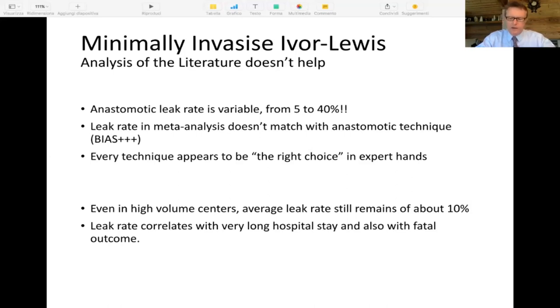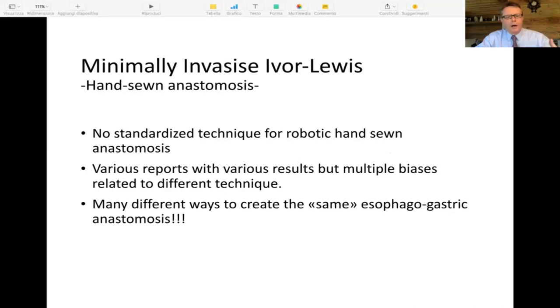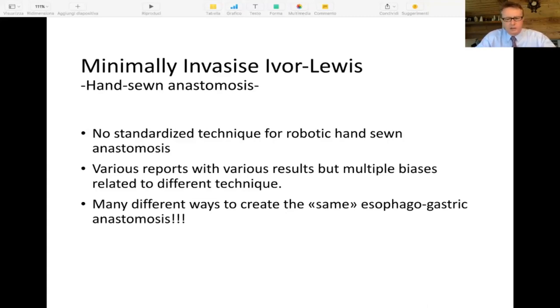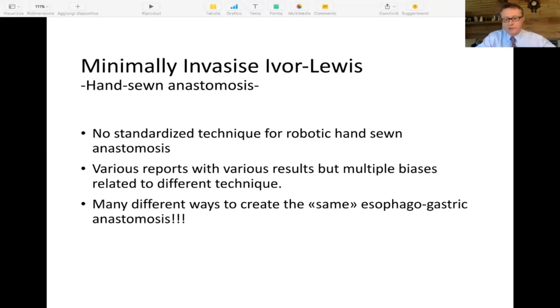Our choice in my institution is to perform a hand-sewn anastomosis using the robot. The reason for using the robot is that you can adjust the tension and have the best possible articulation of the needle as you go through the tissues, creating minimum impact on tissue damage. There is not a standardized technique for a robotic hand-sewn anastomosis, and the results in available literature are biased by many variables — many different ways to create what is labeled the same esophagogastric anastomosis, but in practice it is not the same thing.